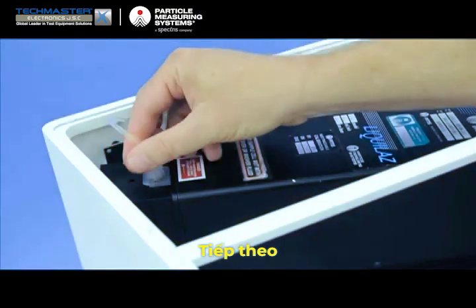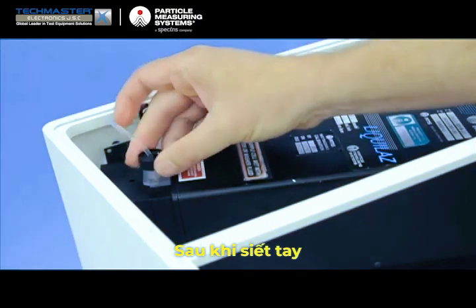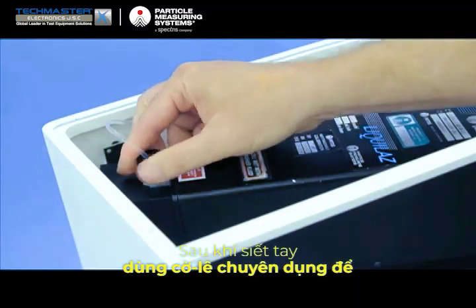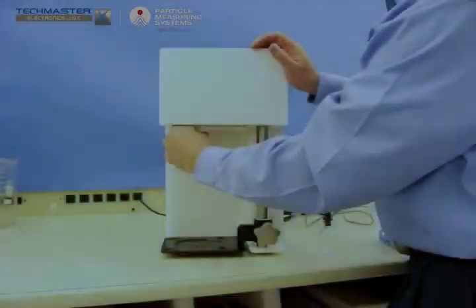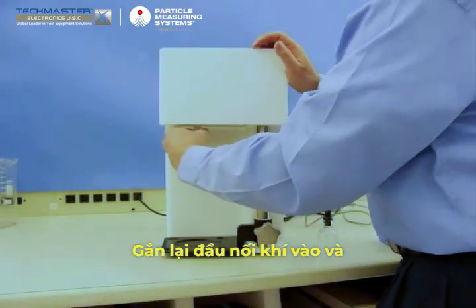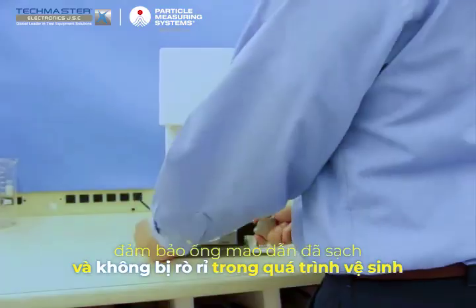Now you will need to reconnect the top fitting to the sensor. After you have threaded it finger tight, use the supplied wrench to snug it up slightly. Do not over-tighten this fitting. Next, reconnect the inlet fitting and run a sample or 2 to ensure that the capillary is clean and no leaks were introduced during the process.